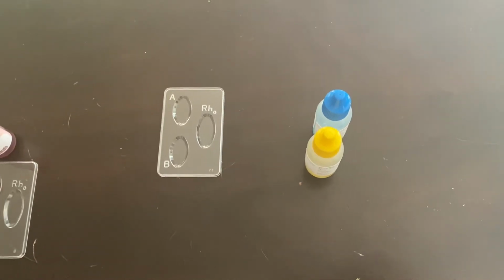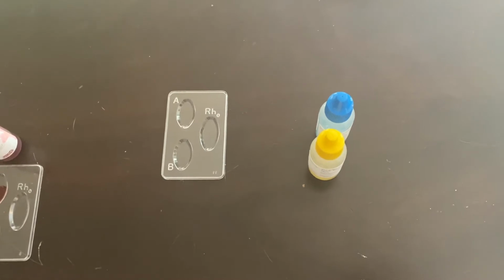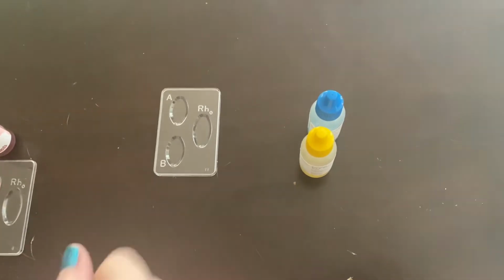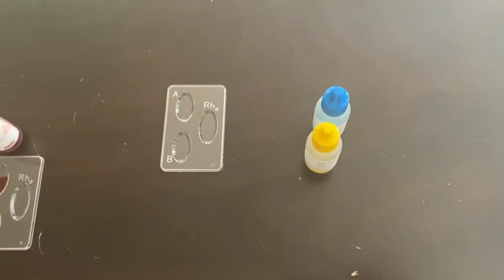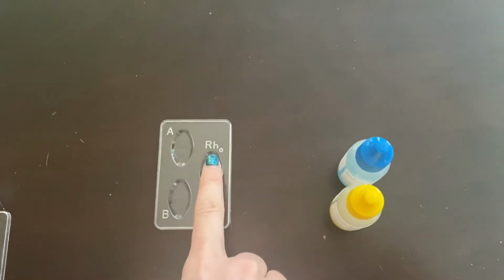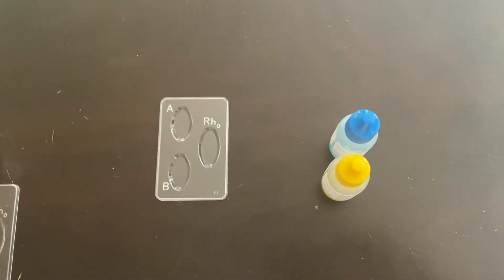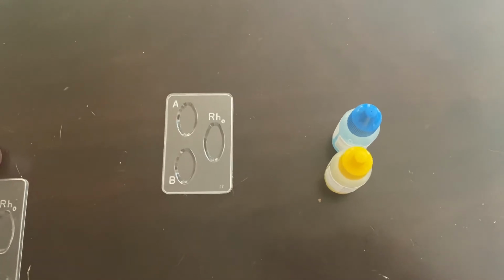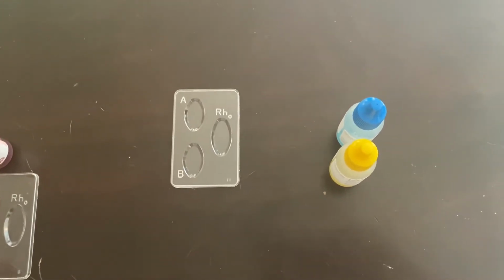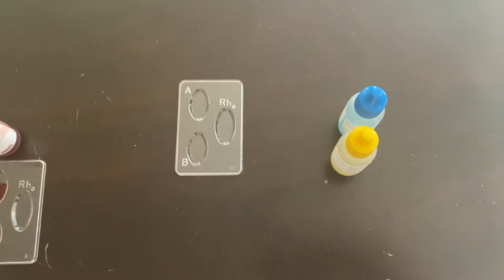I just wanted to demonstrate how you get your blood type and how we would use this in something like forensics, which will be coming up in a couple chapters. So basically, I'm just going to focus on the ABO group. The Rh, which is your positive or negative, you can also do, but it's a whole separate thing. It's basically just to make sure that when you are giving blood transfusions, you're not going to cause anemia, especially in a pregnant woman. So we're just going to focus on the ABO blood group.